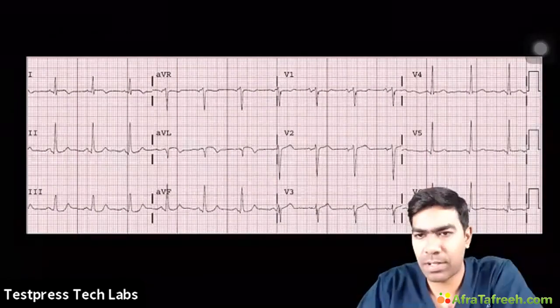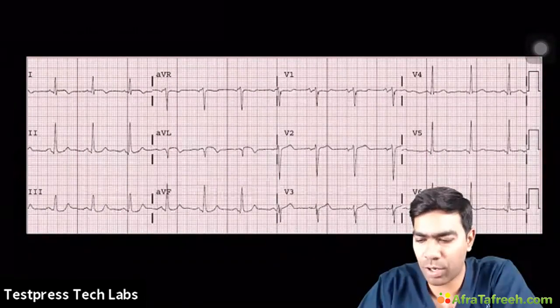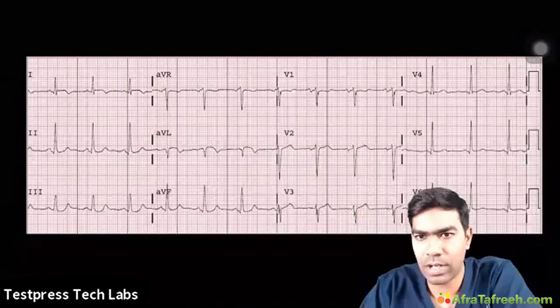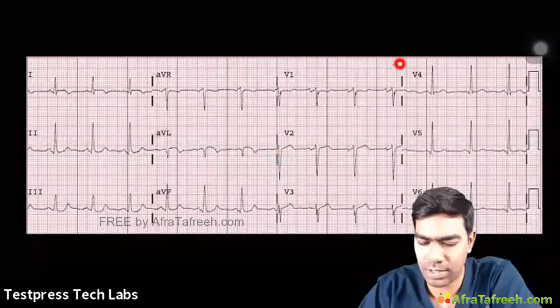This is not a septal MI. See, how can you see? I told you, 80 milliseconds, Niharika, 80 milliseconds from the J point. There is no ST elevation at all. How can you tell it's anteroseptal or septal? There's absolutely no ST elevation in any of these leads.